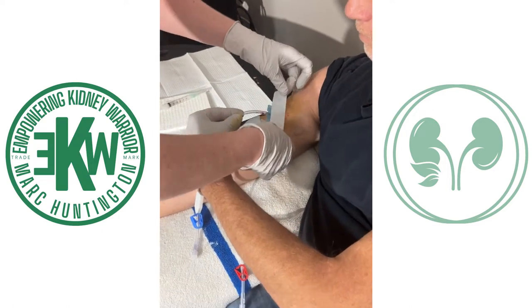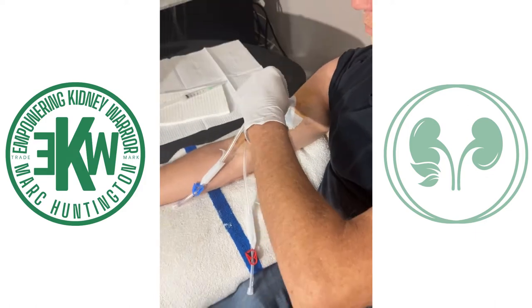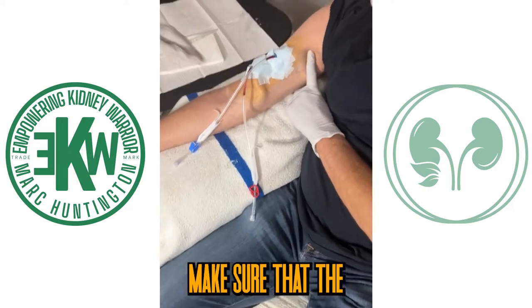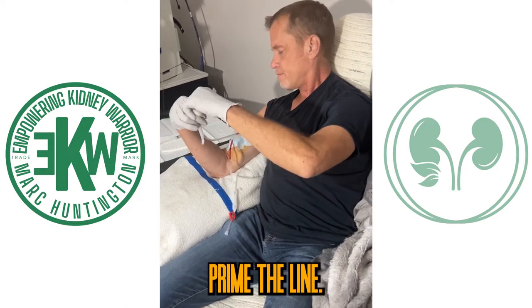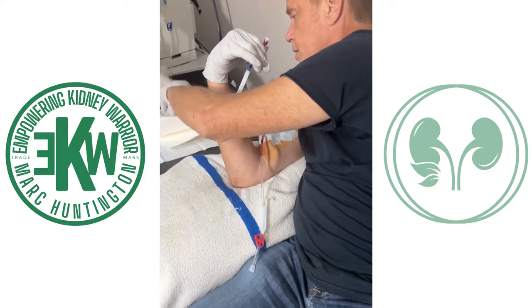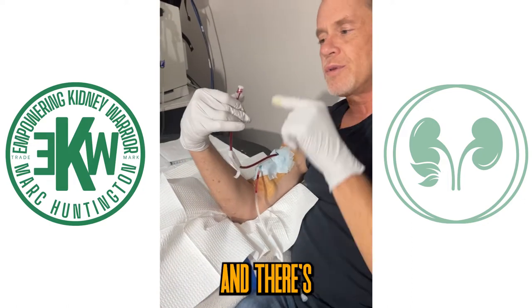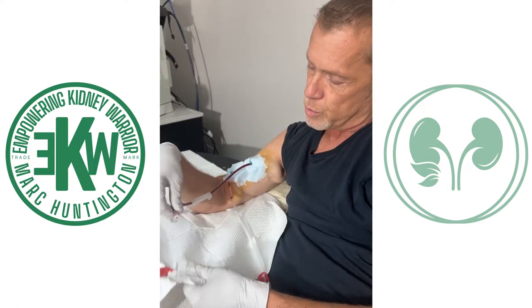Second needle in. Now that we're taped, make sure that the pressure is good and you prime the line. We really have to make sure that it's primed and there's no air at the top, so that when you start the dialysis treatment, there's no air bubbles. Prime it really well. The worst thing we can do is have air bubbles.